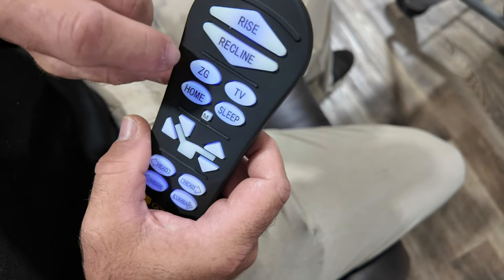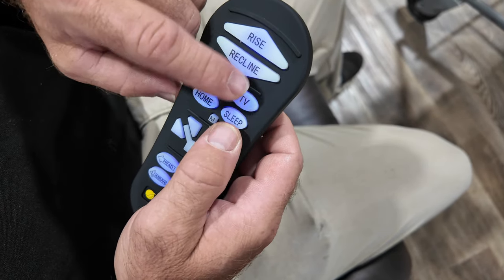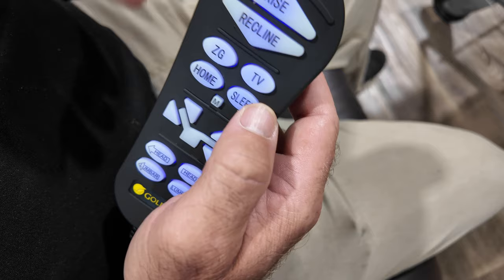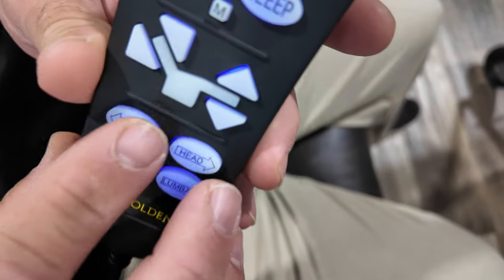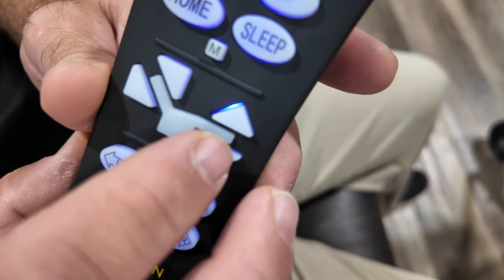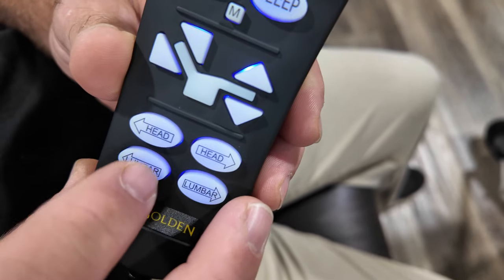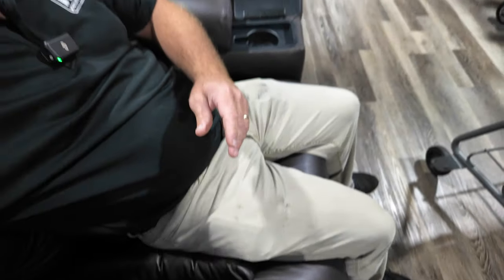Below the two main buttons are memory set buttons — programmable positions. Zero gravity is like a rejuvenate position. TV is for watching TV and can be changed to what you like. Home brings you back to sit, or it can be programmed. Sleep is also a position — this is a sleep chair. The Maxi Comfort technology allows you to sleep in it very comfortably. These buttons adjust the back and feet, and the box moves to prevent a big gap when you're sleeping.